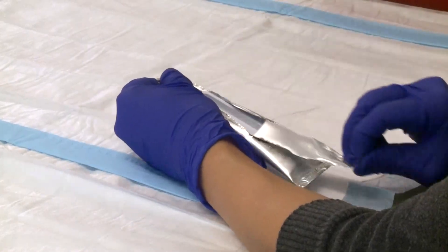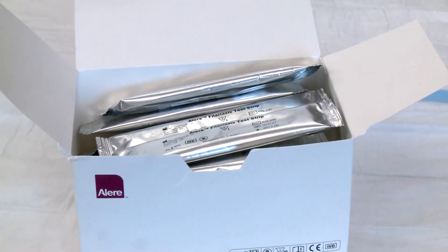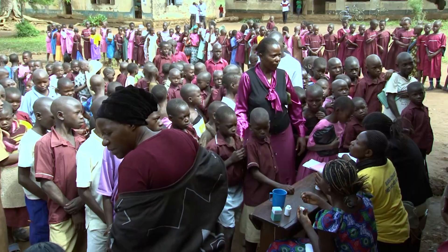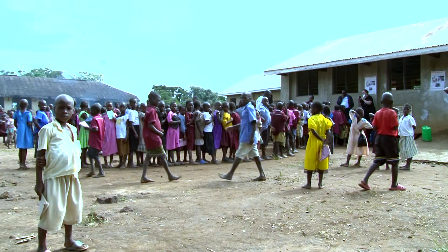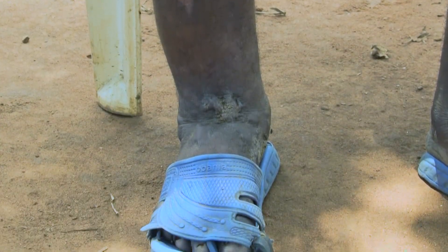This video shows how to properly use the Allaire filariasis test strip. The filariasis test strip, or FTS, is one diagnostic test recommended by WHO for Transmission Assessment Surveys, or TAS, in all areas where Wuchereria bancrofti causes lymphatic filariasis.